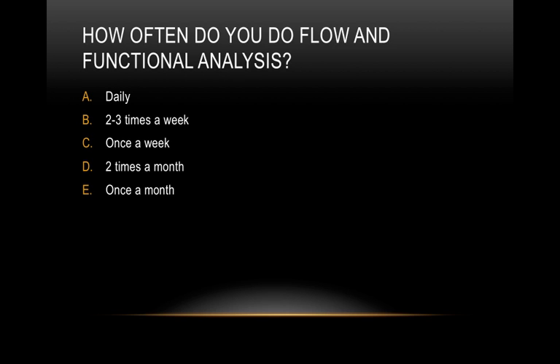So let's get a little bit of an idea about the audience. How often do you perform flow and functional analysis? Daily, 2 to 3 times a week, once a week, 2 times a month, or once a month?